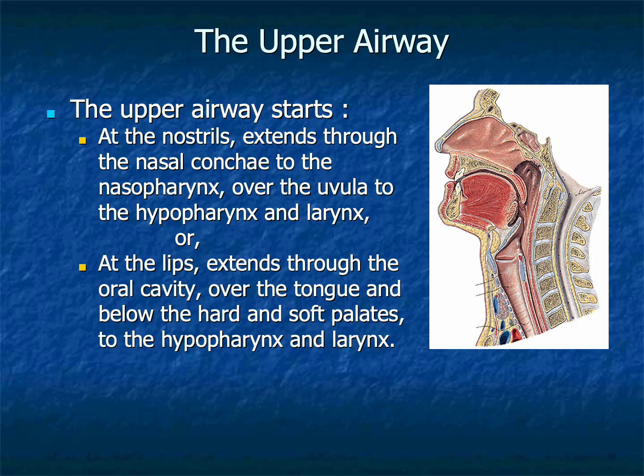The upper airway begins either at the nostrils or at the lips and extends through a series of interconnected anatomical passages toward the hypopharynx and larynx. As the bronchoscope advances, one moves through regions designed not only for breathing, but also for humidification, filtration, swallowing, resonance, and speech. This entire region is dynamic rather than static.